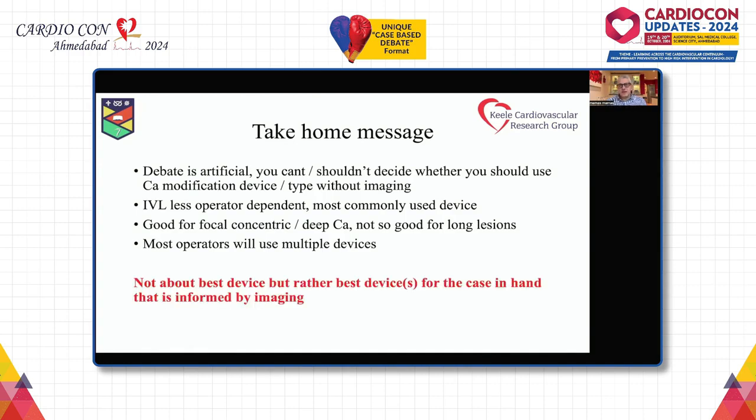I think really the take-home message that I would like to leave with the audience is that it's not about the best device. There is no such thing as the best device. It's rather the best device for the case in hand that is informed by imaging.